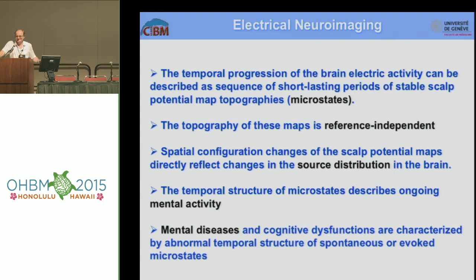I have a third question. We adopted the same procedure, but for the EEG connectivity maps, searching for functional connectivity states in the scalp EEG. What do you think about the k-means? Is there any way to use another clustering or to improve on the assumptions of the k-means clustering? Yes, in the freely available software we also propose other methods than k-means, and also different types of k-means.